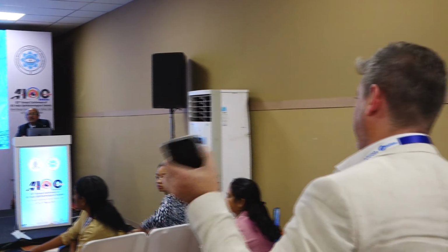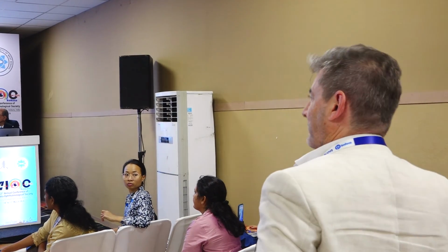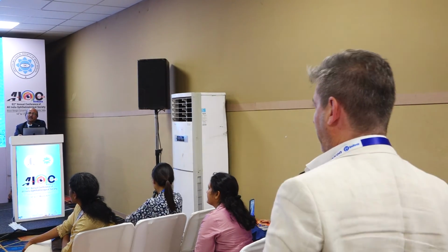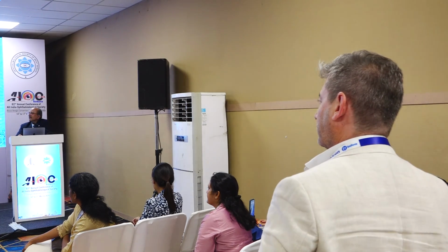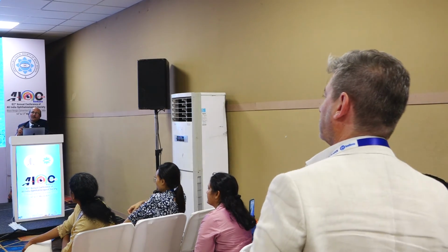Do you consider putting a secondary IOL after 5 years, 7 years, if you have myopia? Yes, myopia. Initially, have you left the child aphakic, or did you put the IOL? You put the IOL. Myopic shift? Sulcoflex, something like that. Yeah, if you get a myopic shift, then you need to exchange the IOL.